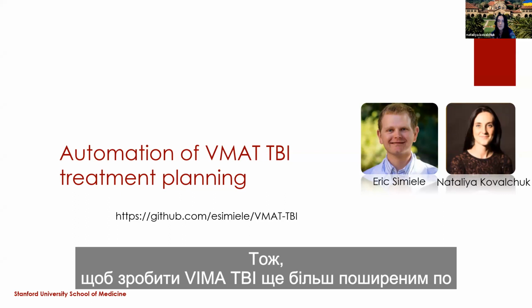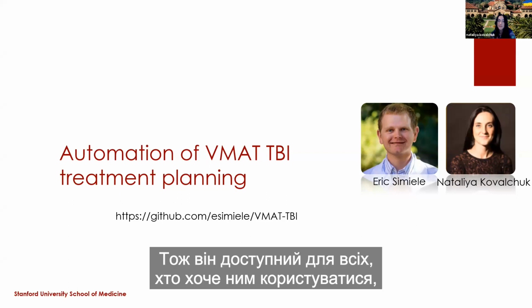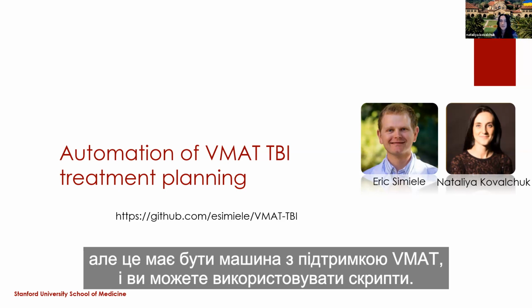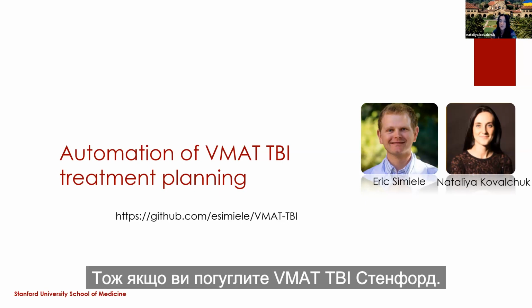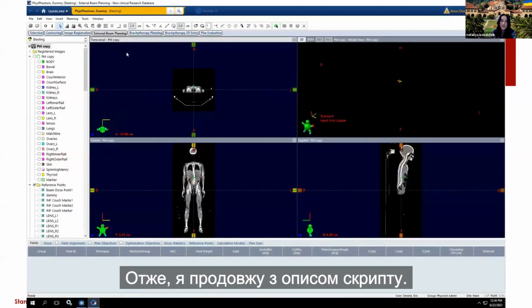So to make VMAT TBI even more prevalent across the country, we also posted the script to GitHub, so it's available to anyone who wants to use it, who has Eclipse treatment planning system and who has Varian machines. It doesn't have to be a TrueBeam, but it's a VMAT enabled Varian machine, and you can use the scripts. So there's also a video presentation that Eric gave about it. So if you Google VMAT TBI Stanford. So I will continue with description of the scripts.